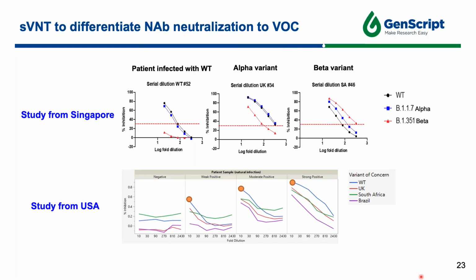The next question is actually a follow-up question from the attendee who asked just now. Are the results of this neutralizing antibody test affected by lipemic samples? For example, in a patient with high triglycerides and serum that appears turbid, will this affect the results? Are there any studies showing this?